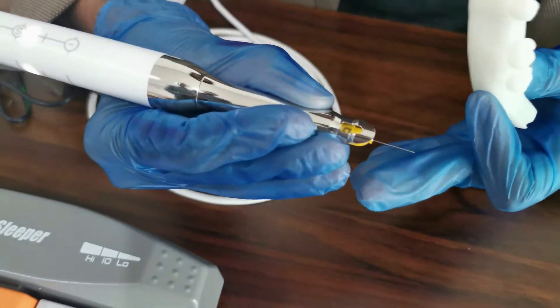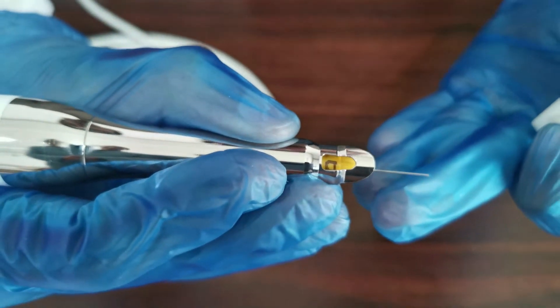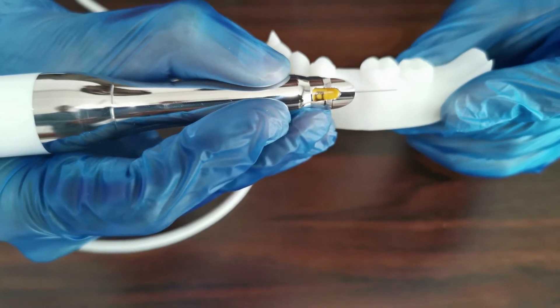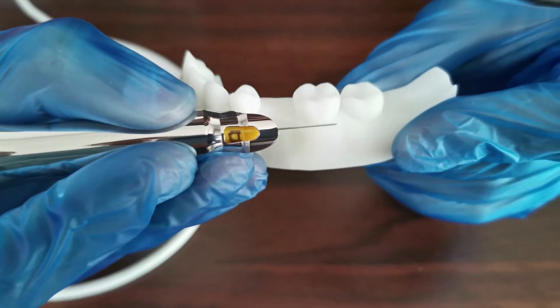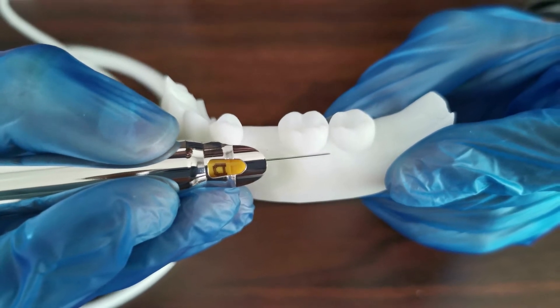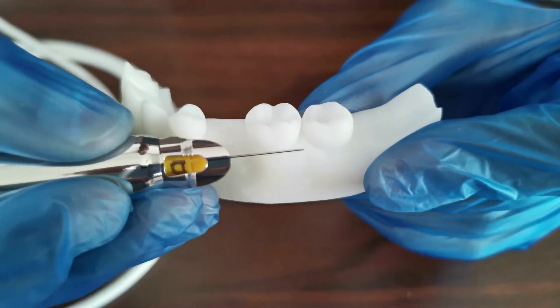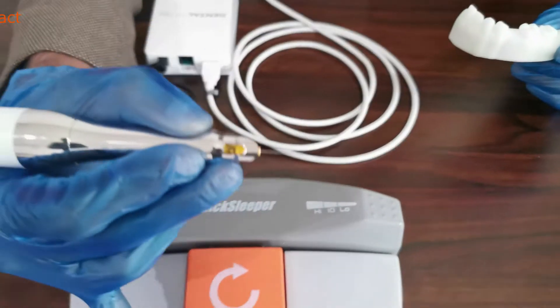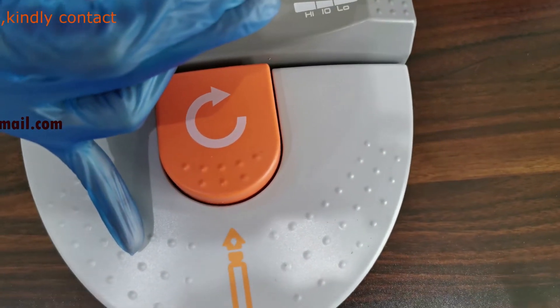The reason being that the bevel is going to be on the opposite surface of the D. So the D is visible, the bevel is going to be on the under surface, and that is going to be in contact with the soft tissue. Having kept this in position at an angle of 15 to 20 degrees, we pierce through the soft tissue effortlessly — it is because of this particular needle that it's possible. Once we have done that, the next thing is to deliver at least two to three drops of anesthesia, done by pressing this particular foot pedal. On pressing this, the anesthesia comes in slowly with a few drops.